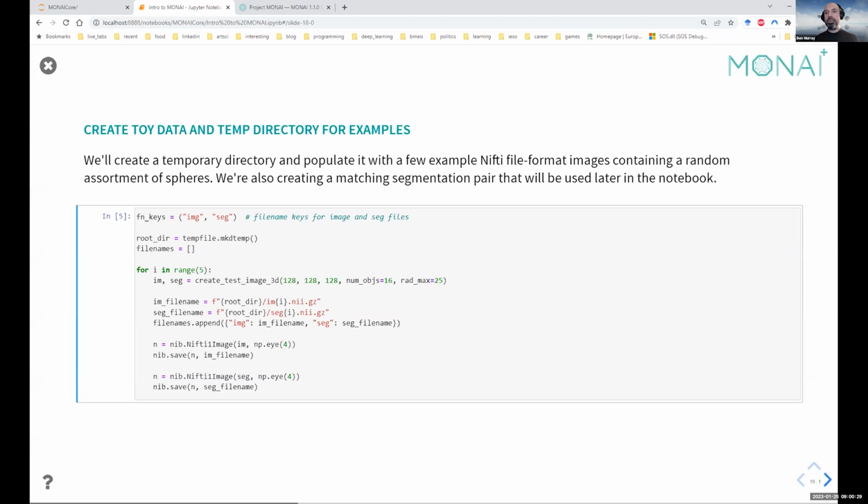You can pass tensors into MONAI transforms, and internally MONAI has the option to treat them as what we call metatensors. And those have metadata that travels along with them as they go through the pipeline. And as such, all of that meta info is audited on the actual tensor itself, and you can go and look at it as additional fields on the tensor.